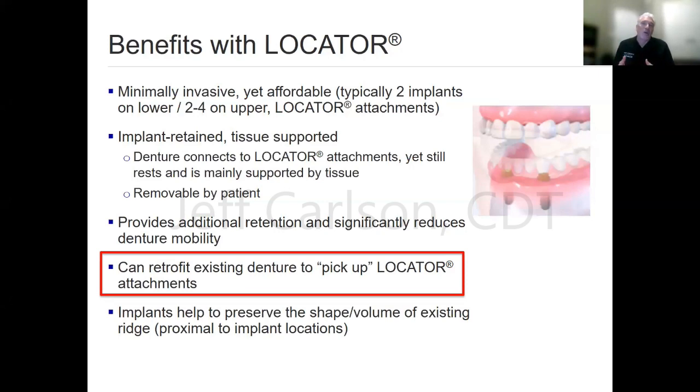I think models with attachments on them are very helpful to have, so the patient can see the different types of attachments. A quick warning about that: when you buy models, and you have, here's a denture example with 2 locators, and you're trying to get it on and off the model, they can have a lot of retention. The patient isn't able to grasp the peripheral border the way it fits in a model, and they're pulling it off. And also, because it's a model, it's hard. It's not like in the mouth where the tissues have give. They're soft and pliable, if you will, that the patient gets this retention off that model.